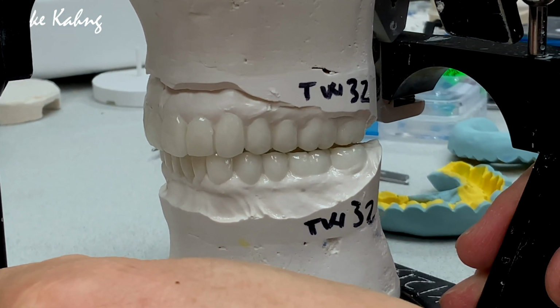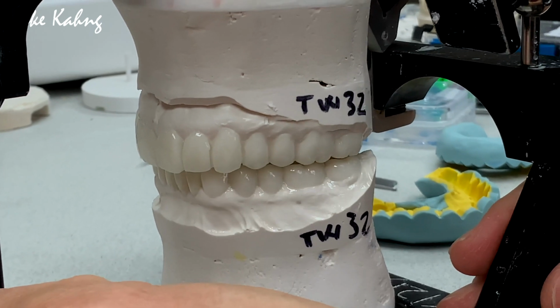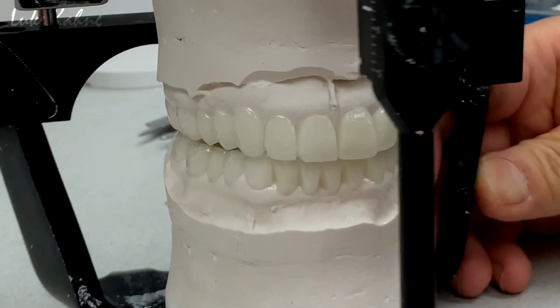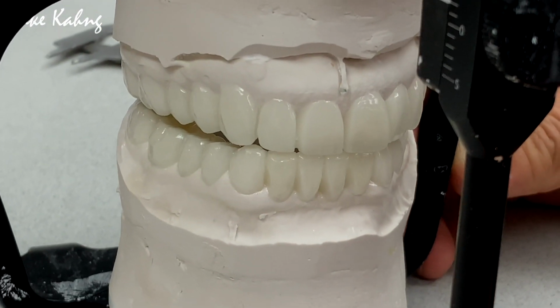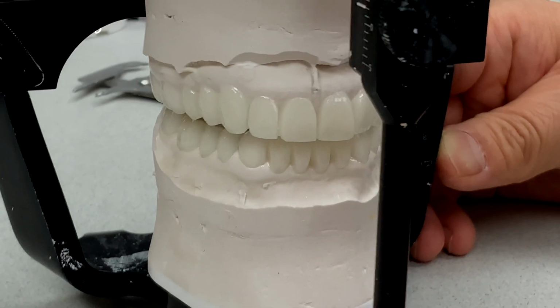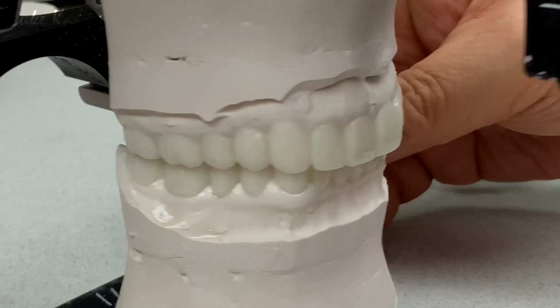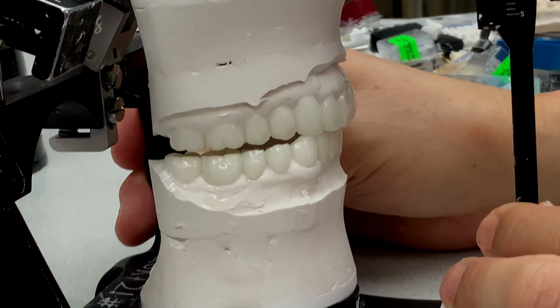Without this diagnosis, it's not going to be easy to do 28 teeth. We all the time recommend this movement from, like I said, protrusions, edge position. We determine inside edge positions, which is non-function on the other side. Whenever patients move laterally, it's non-touching or slightly touching, or the canine must be touching. But the other ones are non-function teeth. This is a one-on-one which a lot of technicians do not know. A lot of good dentists know our concept already.